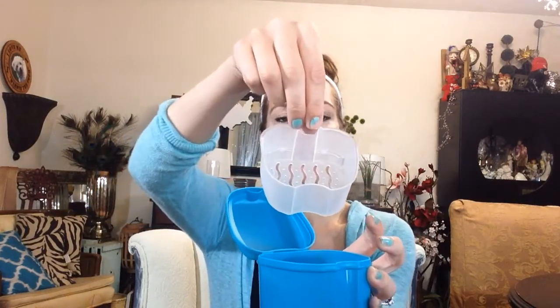I have Invisalign and I need to keep them clean. The dentist gave me this little small case, but it's just a case and I can't put my cleaning tablets in it, so I needed a different one. I found this one on Amazon and I absolutely love it. First off, it's a great size, and second, it has a little basket that you can just pull out and not have to stick your fingers in the water.